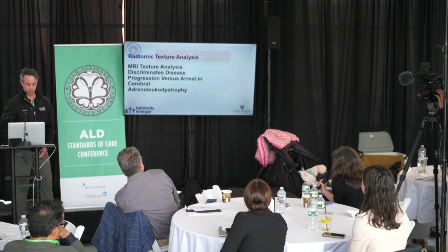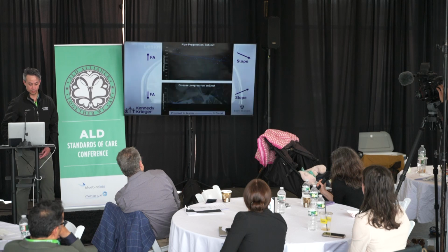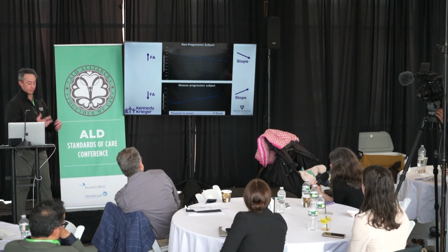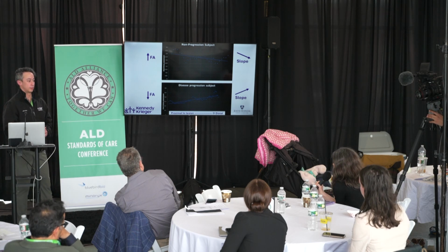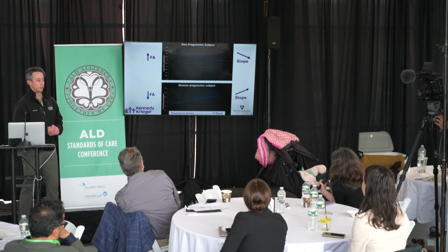In terms of clinical applications, certainly being able to help distinguish, in a situation where we see a lesion and we're not sure if it's active or not, we don't see gadolinium, could something like this be helpful? So that's my first question: do you see possible clinical uses in that example?